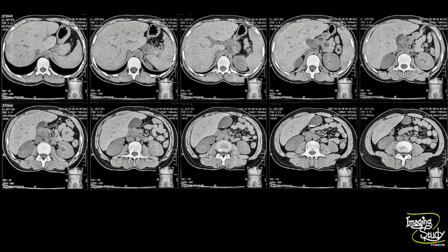This patient came to us for a CT correlation, and here you can see the main pancreatic duct is dilated. Gallbladder shows hyperdense structures indicating thick sludge or calculi. Here you can see the head region shows a hypodensity. You can see the hyperdense area at the pancreatic head region on non-contrast image indicating the parenchymal calcification.